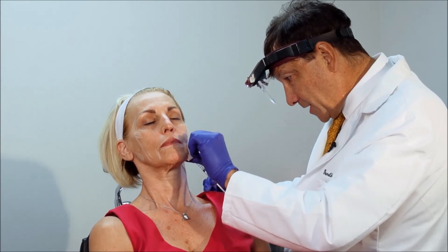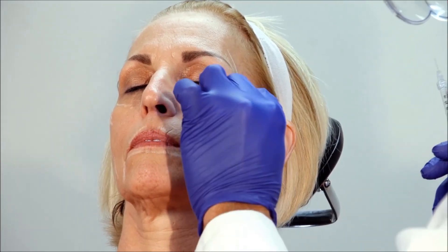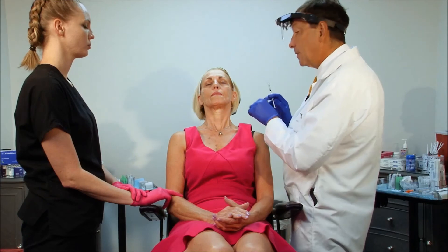I'm injecting about 0.2 milliliters of lidocaine with epinephrine into these insertion points. I'm not going to do it for Botox because we use a tiny, tiny needle for Botox.